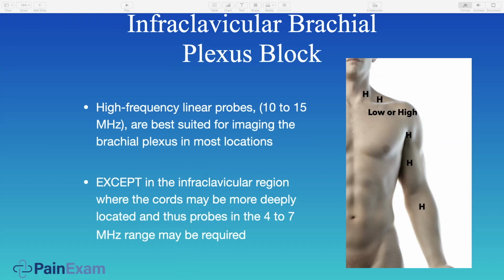This is a slide I created to give you an idea as to when a high versus a low frequency ultrasound may be available. Now, there is an introduction ultrasound lecture that I have. And for those of you who are beginners, I can try to send it to you to go over the concepts of ultrasound. As you know, I just got into everything today without explaining the theory of ultrasound and how it works. So if you're a beginner, some of what I'm saying may be a little bit above your head, but we are going to go over some more basic procedures such as knee injections and soft tissue injections if you're not going to ever use the infraclavicular brachial plexus block or any of these other more advanced pain procedures.